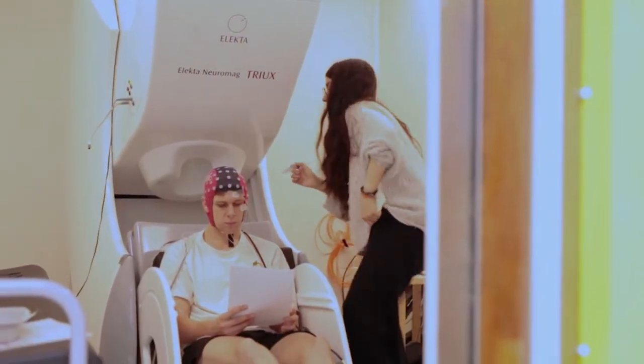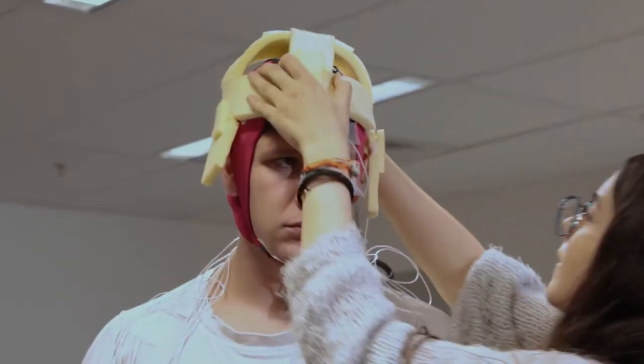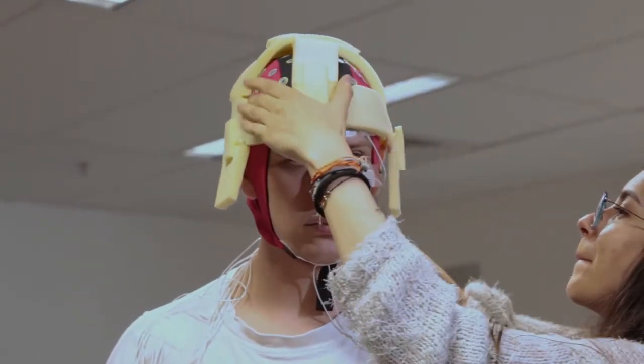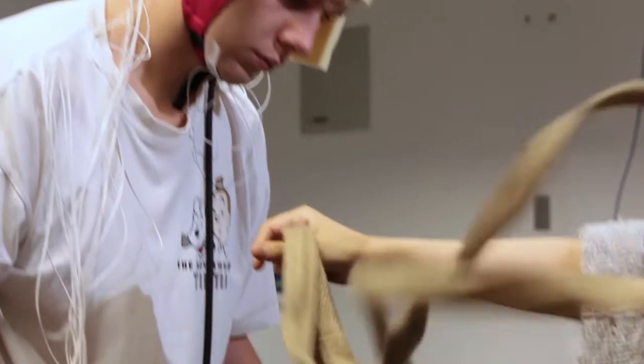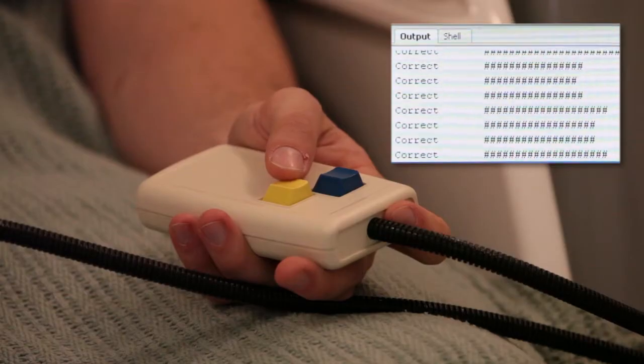The duration of the experiment, as well as the sedative effects of the administered gases, makes minimization of head movement vital. A memory foam head brace is applied in order to reduce lateral head movement, and a jute harness is tied around the body to minimize any vertical movement. Eyes closed resting state and baseline auditory continuous performance task recordings are now performed.